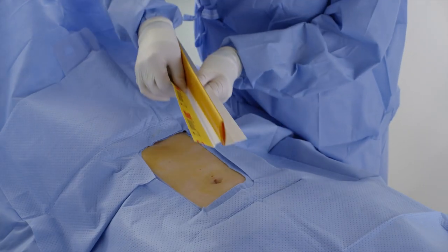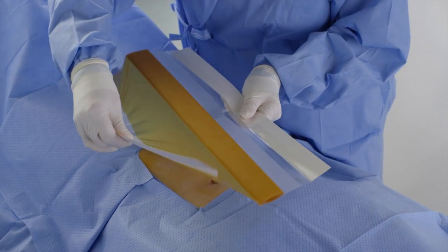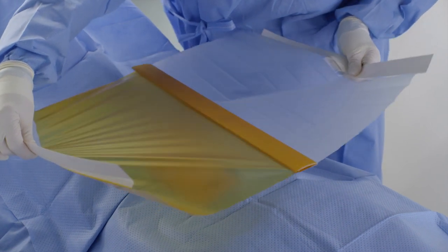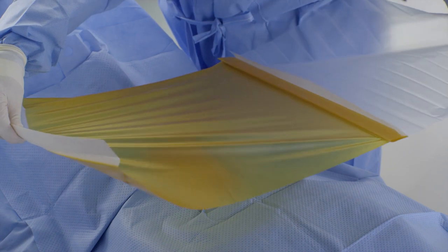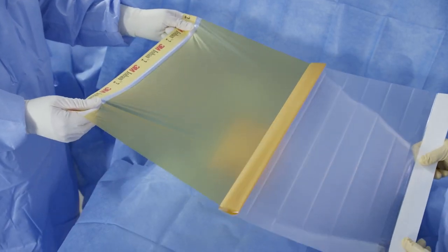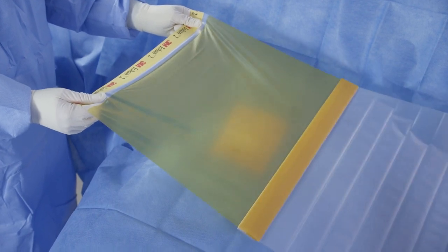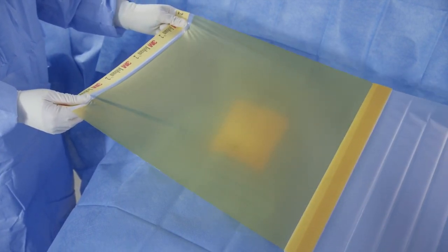If only one person is performing the application, fold the inside straight in the middle of each edge with the printed side facing up and pull in opposite directions to unfold and position the drape above the patient. The drape will need to be almost completely opened before adhering to the patient's body. Stop unfolding the drape if you start to see the clear film appear on the white edge.